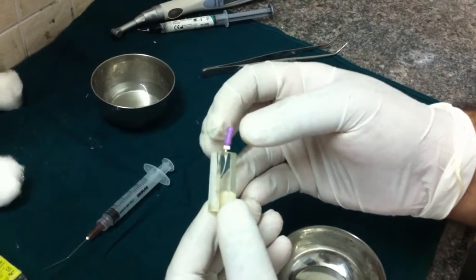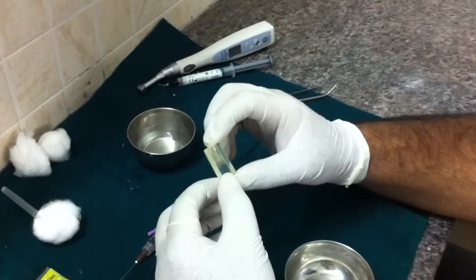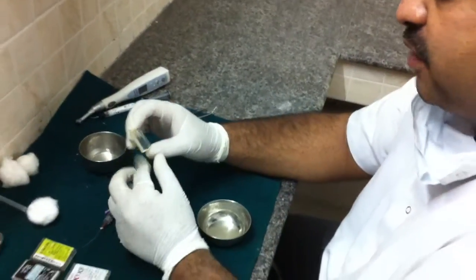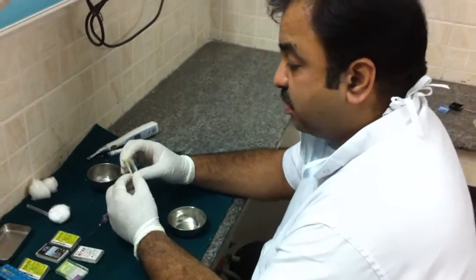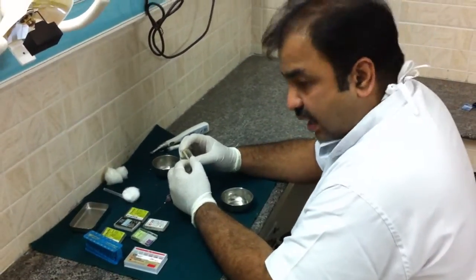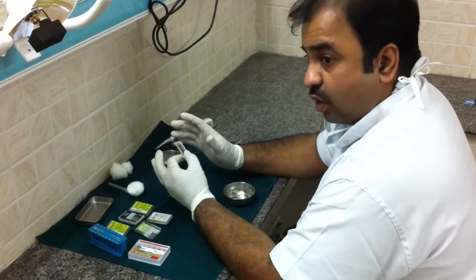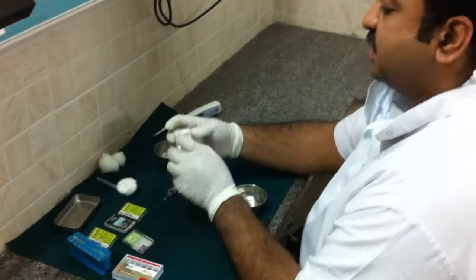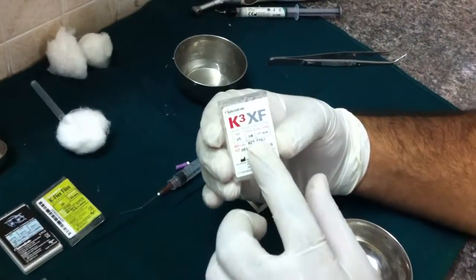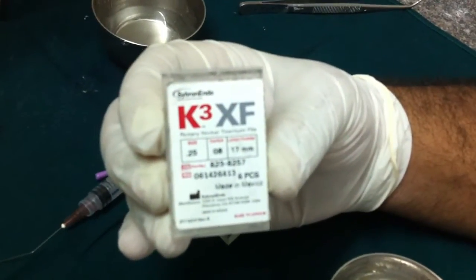Now, after establishing the patency, the first step is the orifice enlargement. Here I would like to add a point. Despite the fact that a lot of manufacturers do not include the orifice shaper in their sequence, I would personally prefer to use an orifice enlarger before you use any rotary system, irrespective of whether it is part of the sequence or not. So here in this case, I am using Sybron's K3XF 25 size 8% taper 17 mm as my orifice enlarger or my orifice shaper.